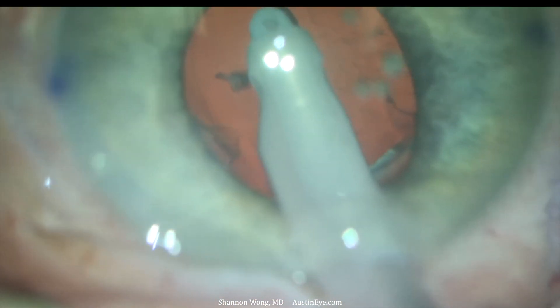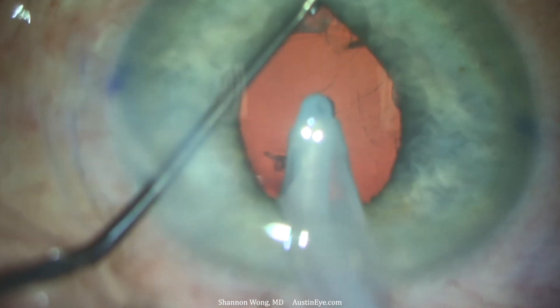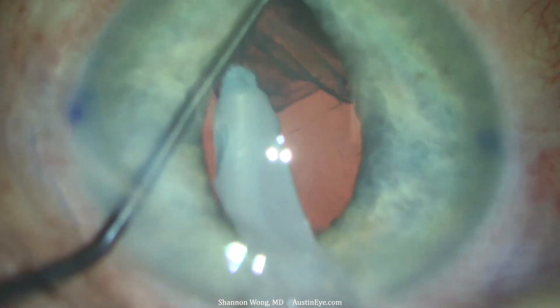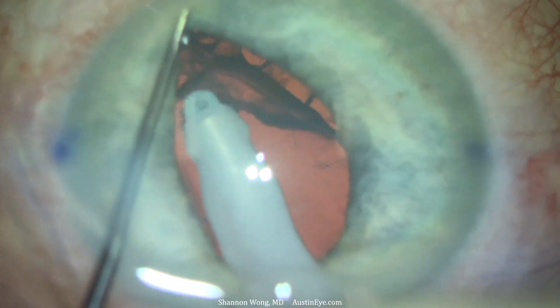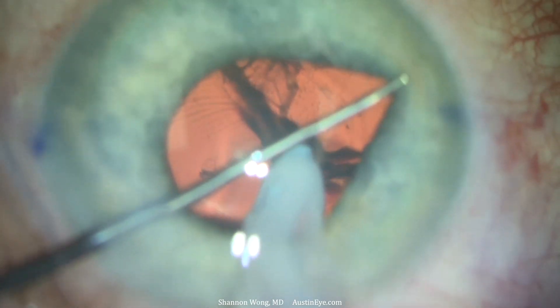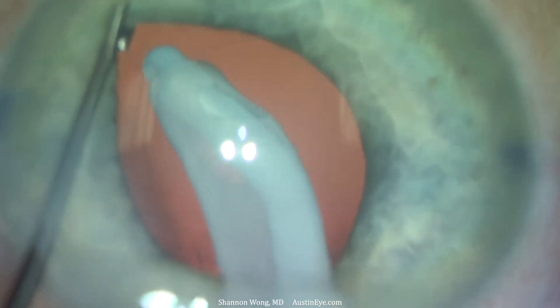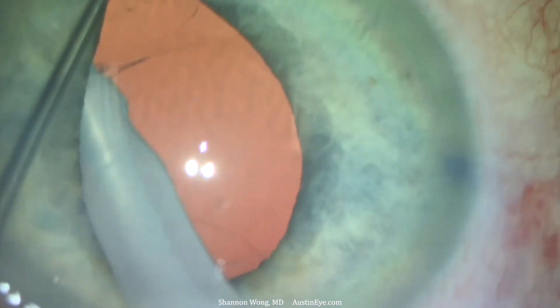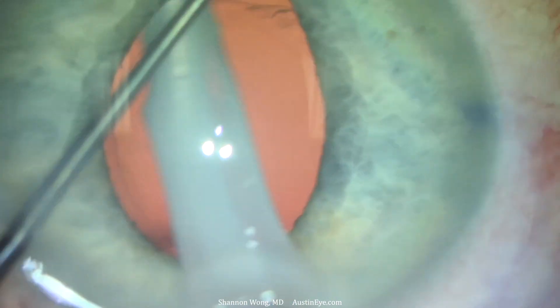We see the pupil becoming miotic and limiting our view of the peripheral cortex. To enable visualization of the periphery, I use a second instrument — a Kuglin hook made by Titan Surgical — to push and pull the iris and facilitate thorough cortical cleanup of the capsular bag. I'm fairly compulsive about cleaning the capsular bag thoroughly to minimize post-operative inflammation, capsular fibrosis, and the need for a YAG capsulotomy, so I polish the posterior capsule thoroughly as well as the posterior surface of the anterior capsule.